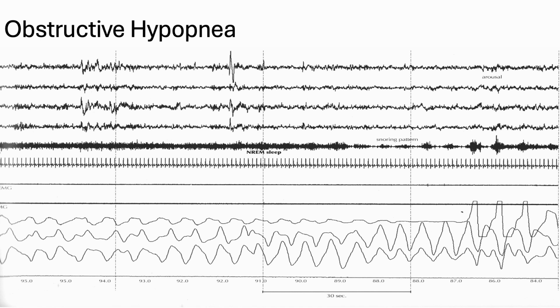If you take a breath in and halfway through, close up your throat while you're still trying to breathe in, you'll notice your torso jumps a little bit. In fact, if you hold your breath and push your stomach muscles in and out, you should notice your chest is moving opposite from your abdomen. This is paradoxing or paradoxical effort. So when you see little bumps in the effort, try and figure out on yourself what would make that happen. If you see a little breath and then a big breath, try and feel what that would feel like.